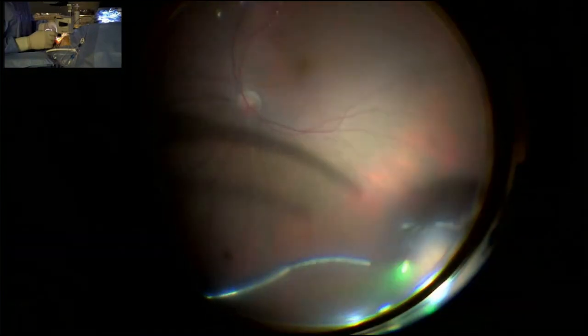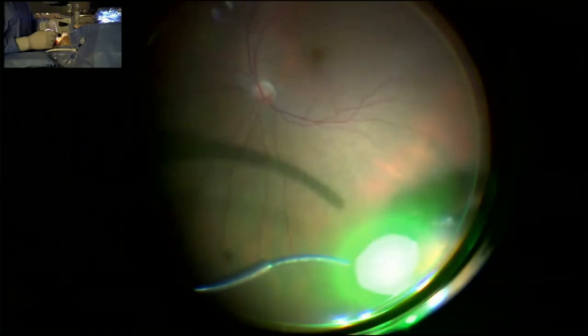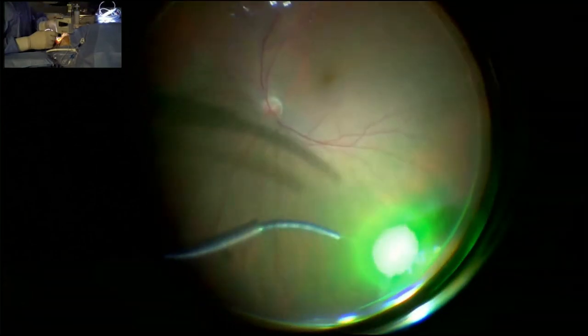So we are doing laser now. In this patient, there is no tear on the other part of the retina. We only have a retinal tear here and also in the inferior part. But there is some lattice degeneration elongated on this nasal part, and I will do laser also in this area.